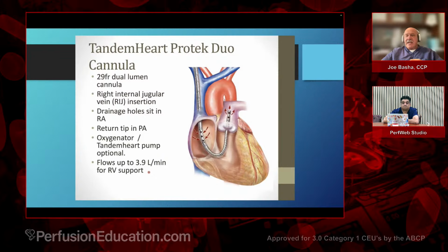So if you have your post-pulmonary emboli, your right heart has taken a hit, or maybe post-cardiotomy where you didn't protect the right side very well, and your right side has taken a hit and it's going to need 5 to 7 days to recover. It's still working, but it was strained. This is actually a very good cannula, I believe, for that.